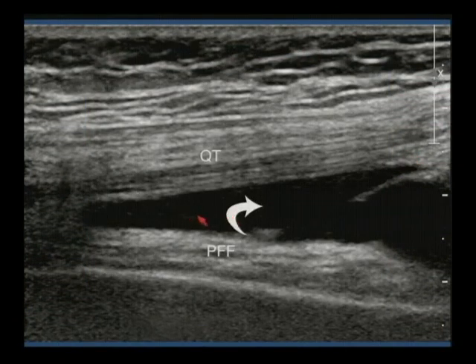And then here's another case, again, different patient, but the same plane, the longitudinal or sagittal plane. Here's the quadriceps tendon, and we can see that nice hyperechoic fibrillar appearance. We haven't quite gone down enough to include the superior pole of the patella. This is the femoral cortex anteriorly.